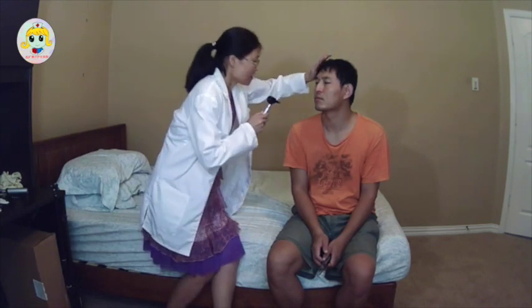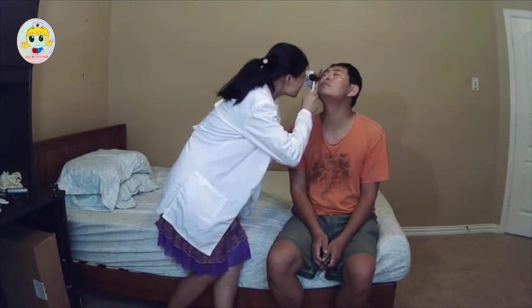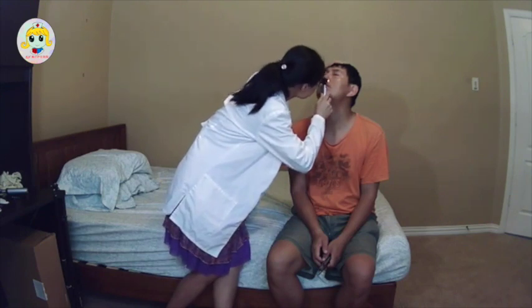Then I will look inside your nose. Okay, I will use the otoscope, and there is a light to observe the inside of your nose. You can relax. For both sides, the nasal mucosa is pink and moist. There is no foreign body, no deviation, no drainage. The septum on both sides is intact.